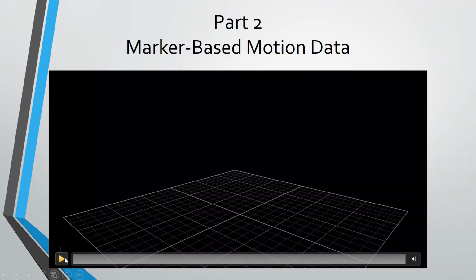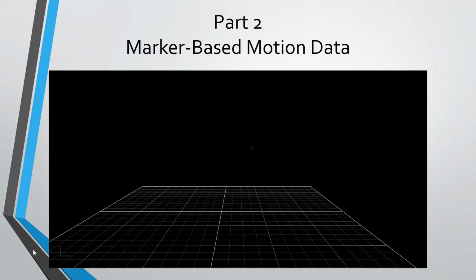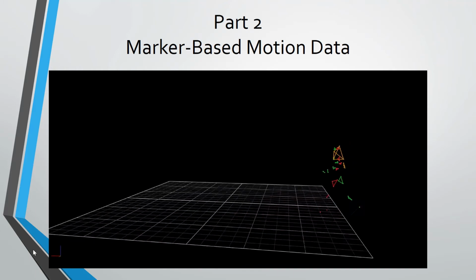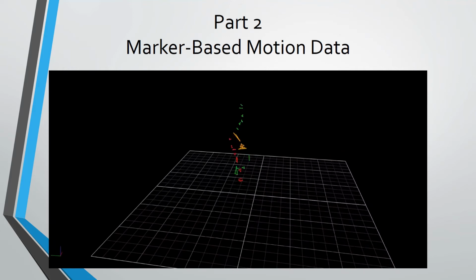So now we can begin to create our little marker man here, and it's starting to take a bit of form now. It looks a bit more human, but this still isn't useful or meaningful data. It's still just some dots, just now they're coloured with some lines in between, and it just looks a little bit prettier, but it's an important step as we move on to begin to model our data. And in order to do that, we have to look a little bit closer at the data that we've collected.